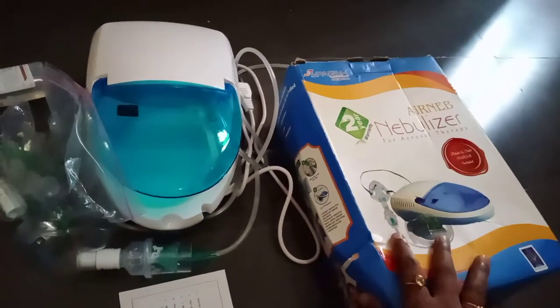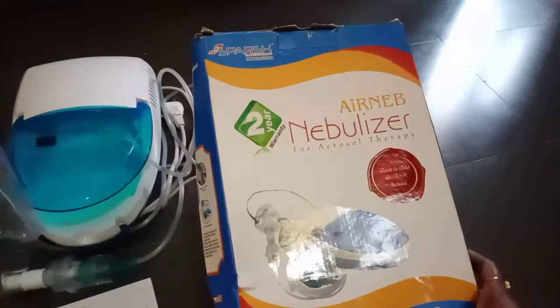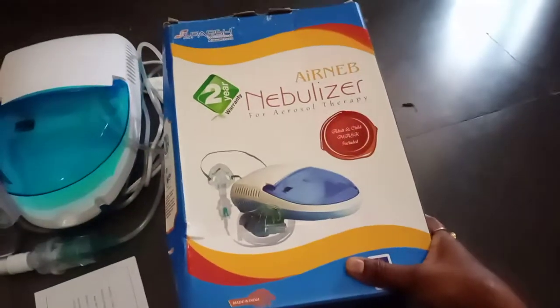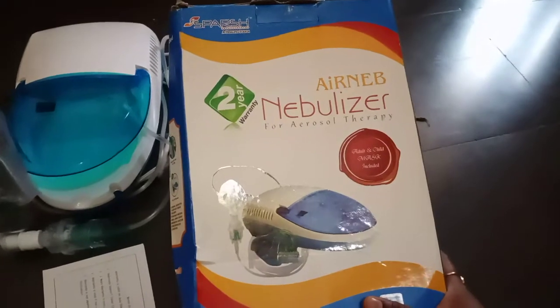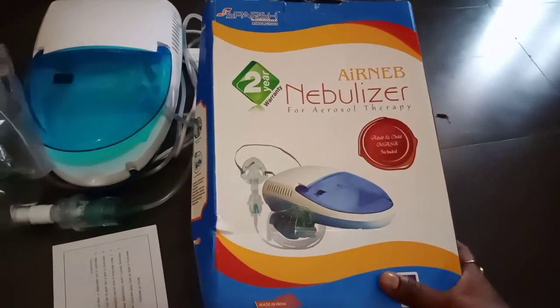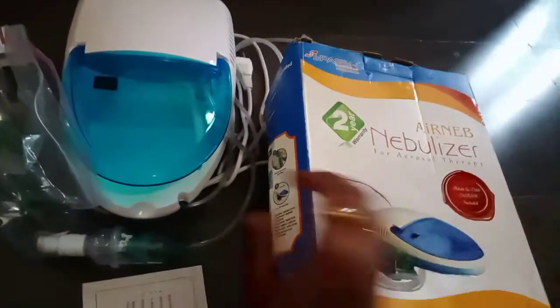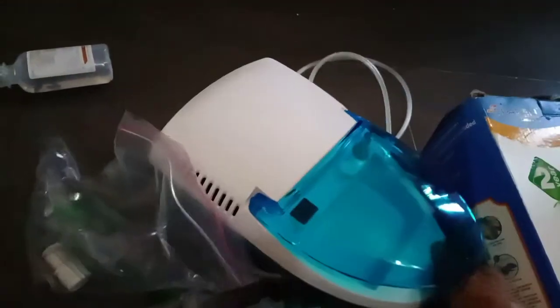What are we going to talk about? The machine is a little bit old — it's 9 months old. It has a 2 years warranty and it's called an Air Nebulizer. The machine has a backup plug. This is the back side of the bag.